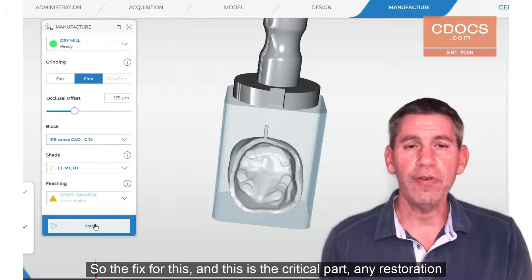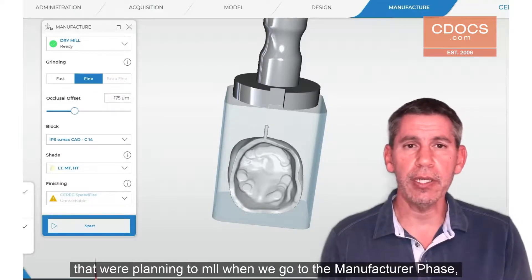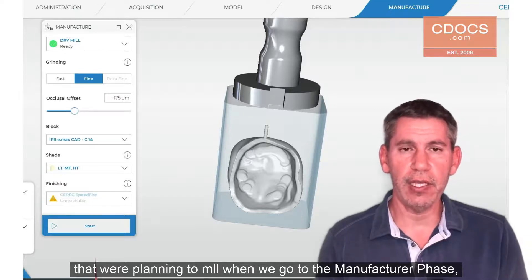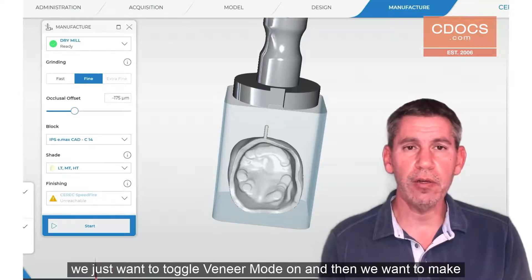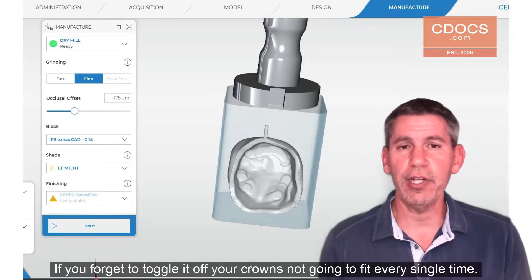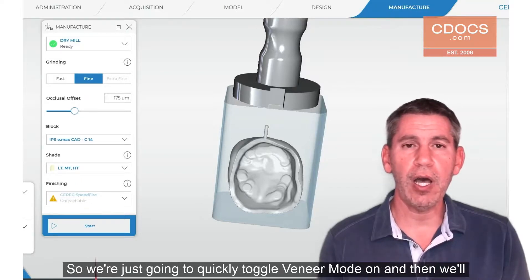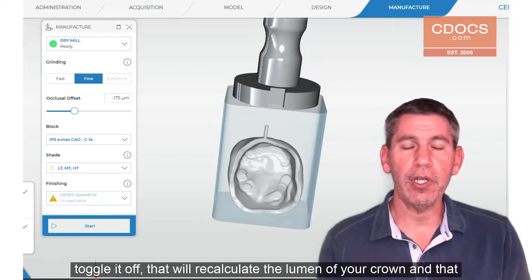The fix — and this is the critical part — for any restoration that we're planning to mill: when we go to the manufacturer phase, we just want to toggle veneer mode on and then toggle it off again. If you forget to toggle it off, your crown is not going to fit every single time. So we're just going to quickly toggle veneer mode on and then toggle it off.